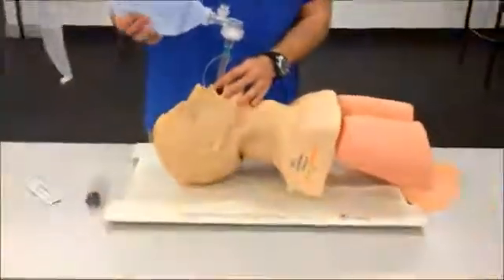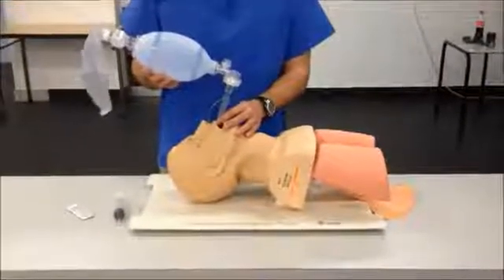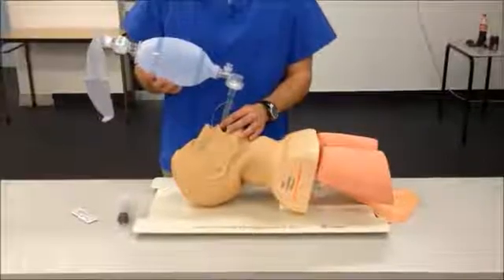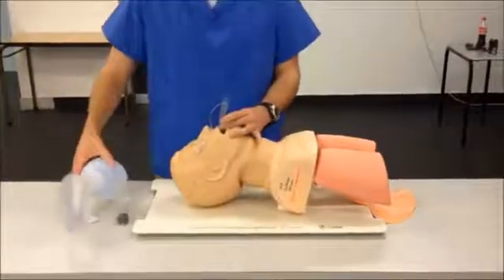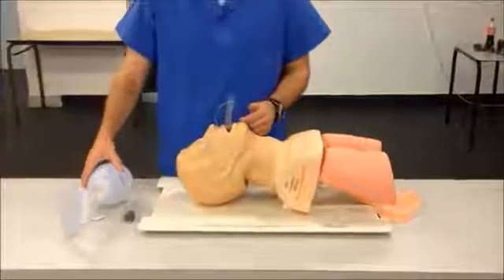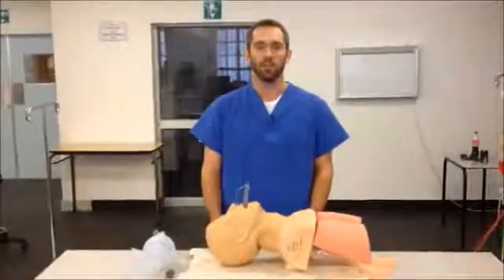Ventilate the patient and confirm chest rise, and also listen into the epigastrium to see if there's any gurgling of air. At this point, you would secure the LMA to the patient and continue with your ventilation strategy. And that's it, correct insertion and use of an LMA.